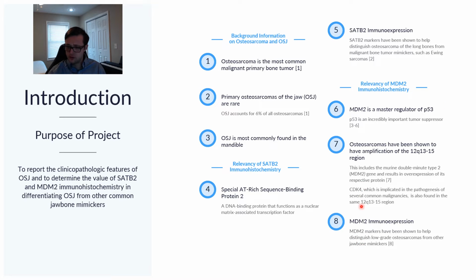With this background information in mind, the goal of our study was to report the clinicopathologic features of osteosarcoma of the jaw and to determine the value of SATB2 and MDM2 immunohistochemistry in differentiating OSJ from other common jawbone mimickers.